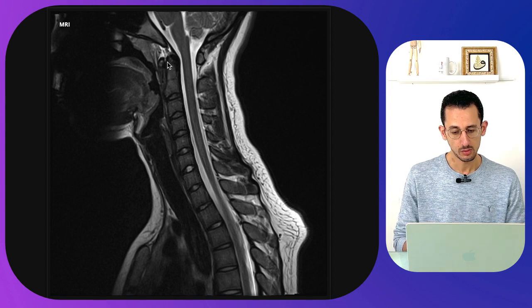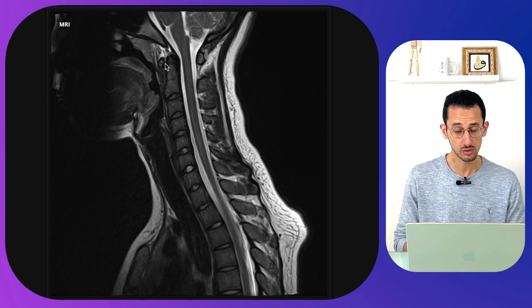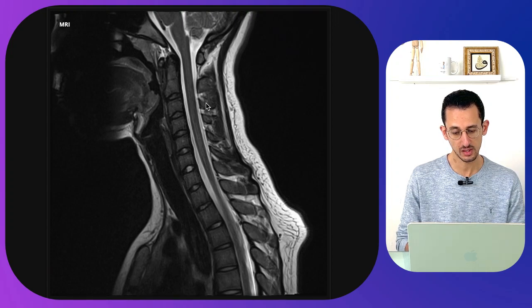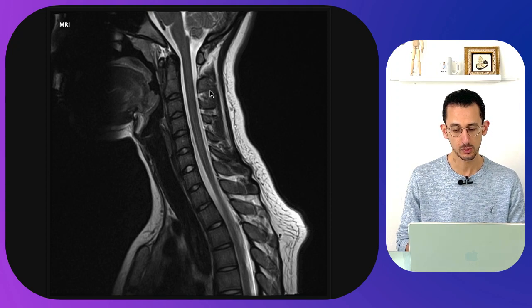At the top, we can see the space between the C1 anterior arch and the odontoid, which is the atlantodental interval. Posteriorly, the spinous processes of C2, C3, C4 and so on are visible, and the space in between is the interspinous space, which contains the interspinous ligament.